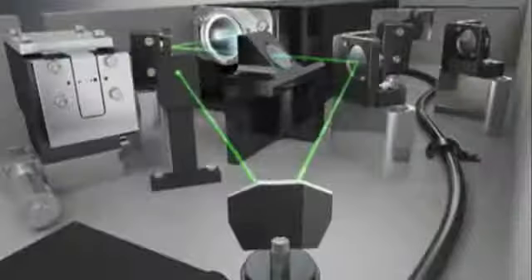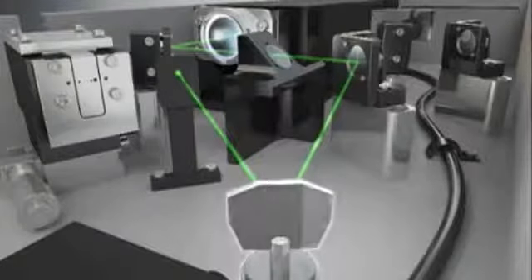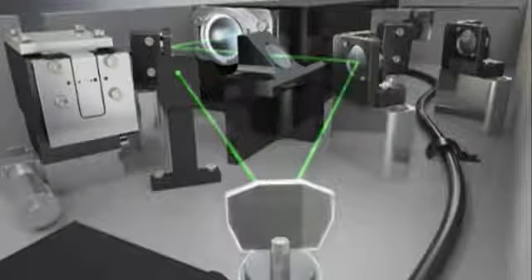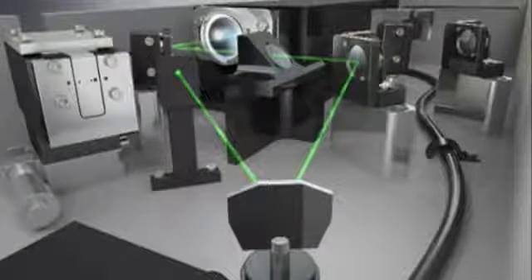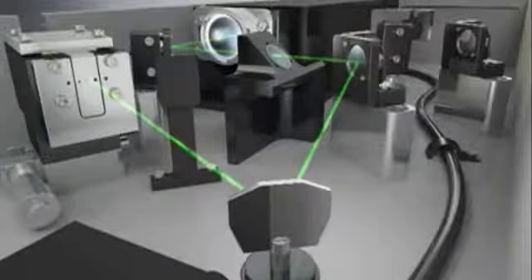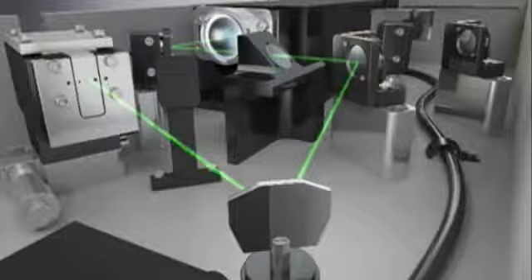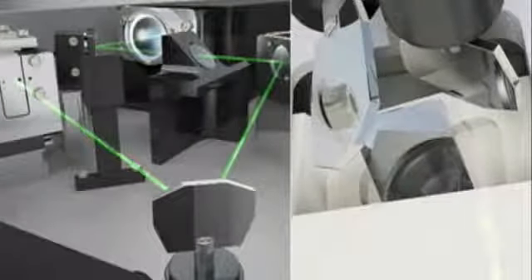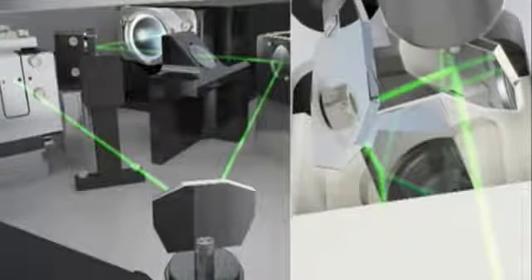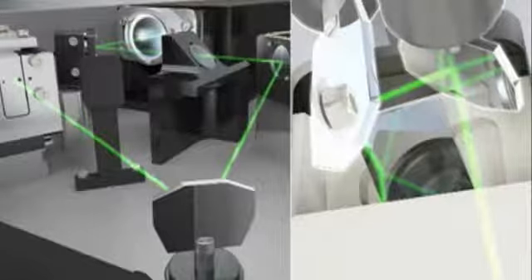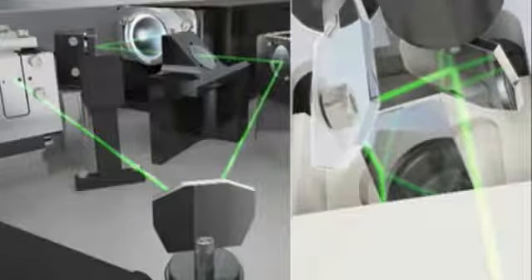PASCAL's laser fires a continuous beam at the first high-speed galvo, located in the laser console. A mirror on this galvo momentarily directs the beam into a fiber-optic cable to create a pulse. This pulse travels through the fiber-optic cable to the slit lamp, where PASCAL uses two additional galvo mirrors to deliver the pulse from the fiber to the retina.